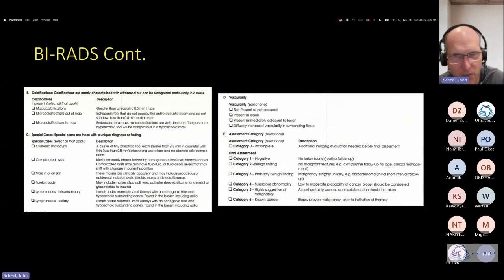They mixed terms up, they were using terms incorrectly, and sometimes just made up terms. And this is expected, because the person performing ultrasound performs ultrasound of all different body parts and shapes and disease processes. So when you're handwriting or typing reports, it's hard to have a mastery of all these terms.